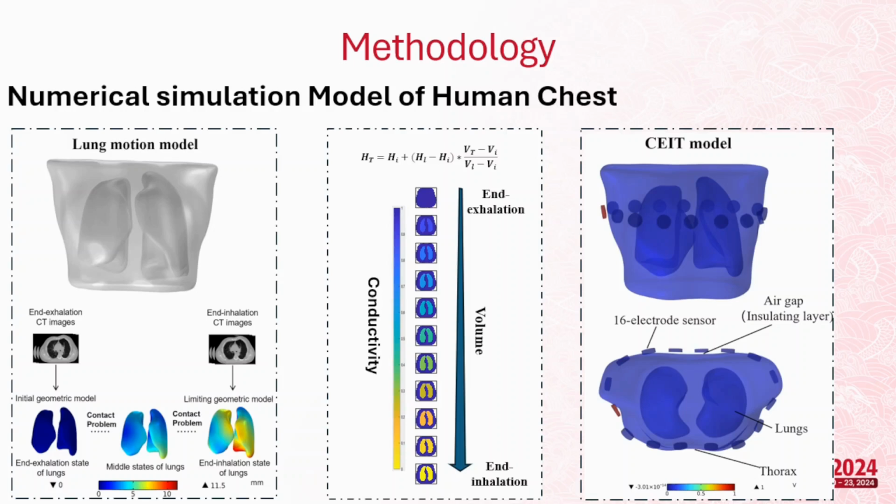Then this is our digital twin model to generate more and more data for future AI-driven, data-driven things. Because in reality, if you want to do EIT powered by AI, you need a lot of labeled data, but it's hard for people to get the ground truth of your lung, except by using CT to scan the patients, which is very harmful for the patients.